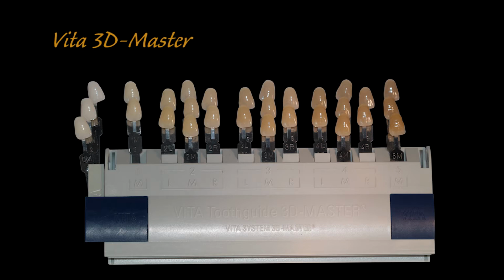Now, don't be intimidated by this. We're going to now work on how do we break down the selection of a shade using this shade guide. And this is why I like it, because this is a fundamental process of elimination shade guide. So let's get into that.